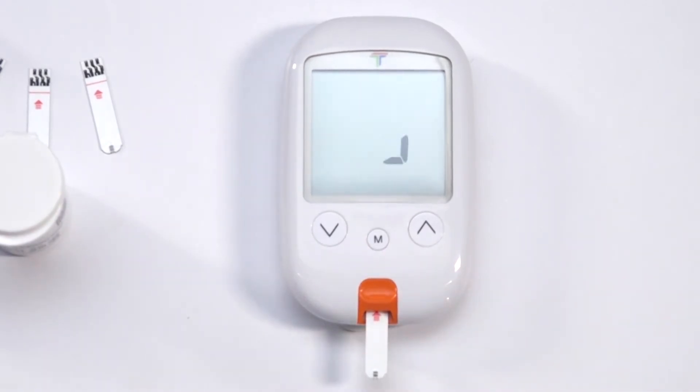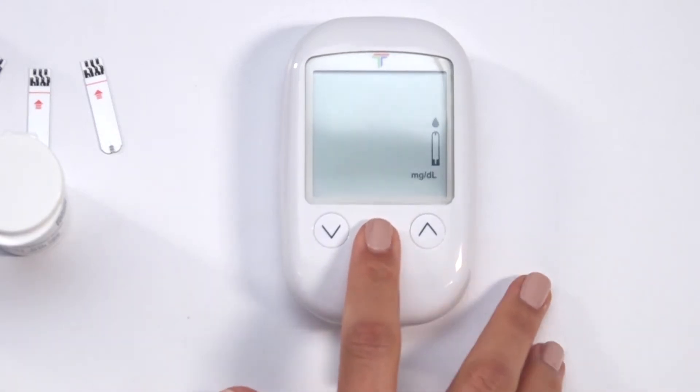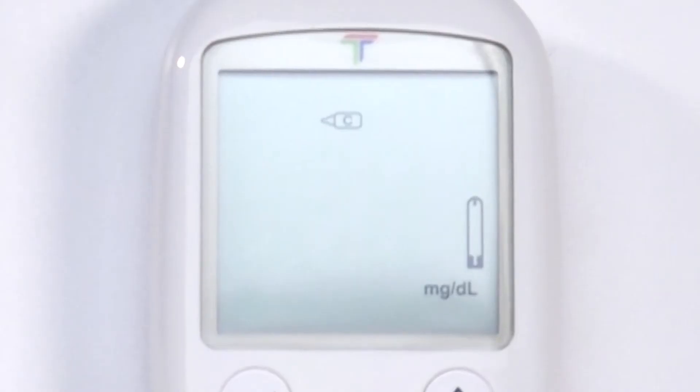The meter will automatically turn on. A beep will sound and the system check will appear, followed by a flashing blood drop icon. Press and hold M for 2 seconds to change to the control solution test mode. A control solution icon with a C will appear on the display.